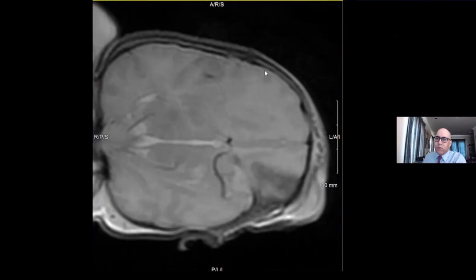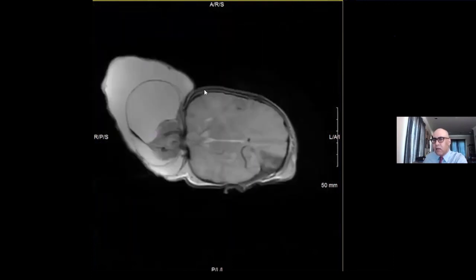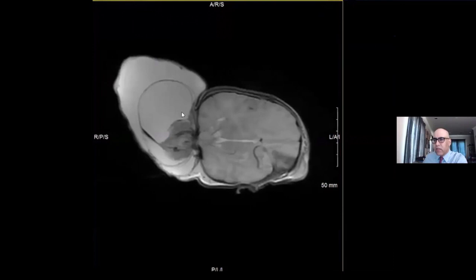This is an MRI of the brain performed in a 1-day-old child that had a known posterior fossa developmental abnormality in utero. The head is on its side right now due to this abnormality. So if we zoom out, we can see there is this occipital encephalocele, and we have protrusion of brain parenchyma into this encephalocele, and we have cystic membranes in there and a large CSF collection posteriorly.